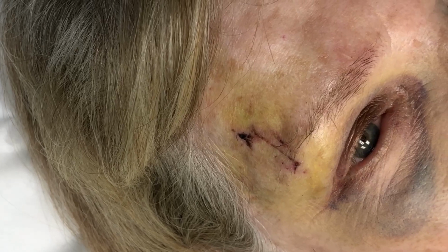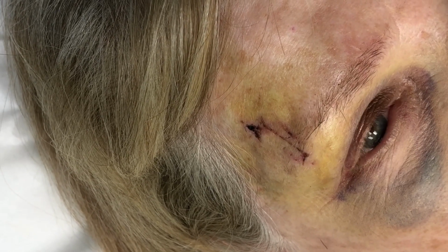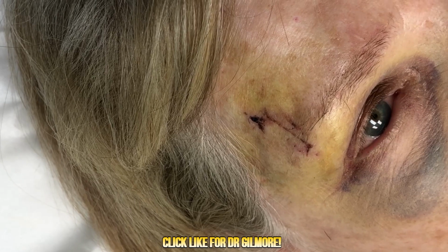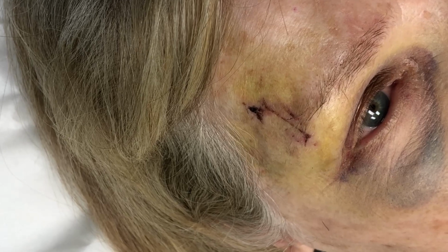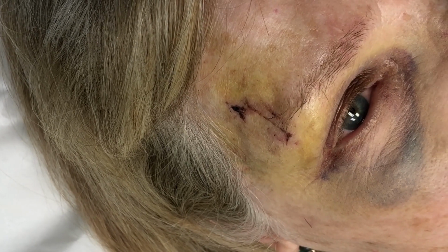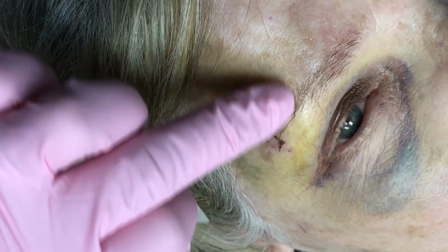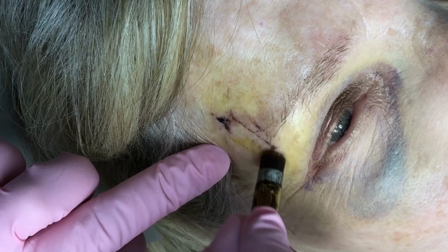All right, now the next thing we're going to do is put some steri strips on. And the steri strips, we call them smart strips. What they're going to do is help give the skin a little bit more support for a few more days. They'll fall off on their own, okay? So you don't have to worry about when to take them off. Now, the bruising and the discoloration that you're seeing, all of that is very, very normal with this kind of injury. So you don't need to worry that something bad is happening. Your body will take care of that. It's a very shallow bruise you have.